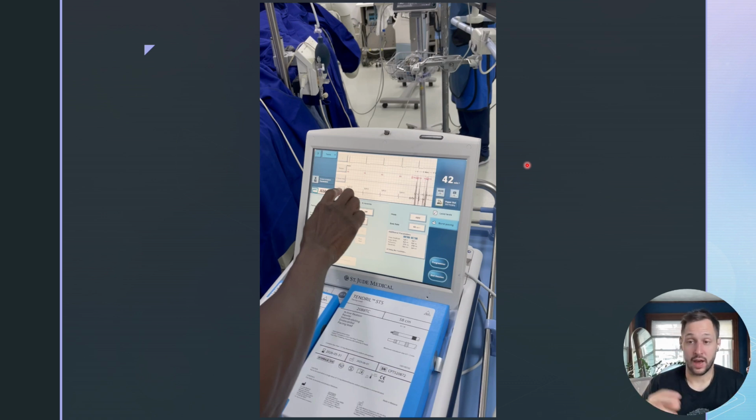Greater than 2000, 3000 impedance could indicate a couple things. It could indicate perf. It could also indicate that you've just hooked up your PSA cables a little bit incorrectly, so they're not properly seated on the ring and tip electrodes at the back of the lead. So if you have an out of range impedance, check your cables first, right?